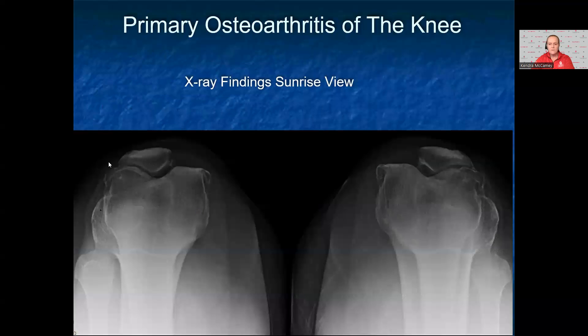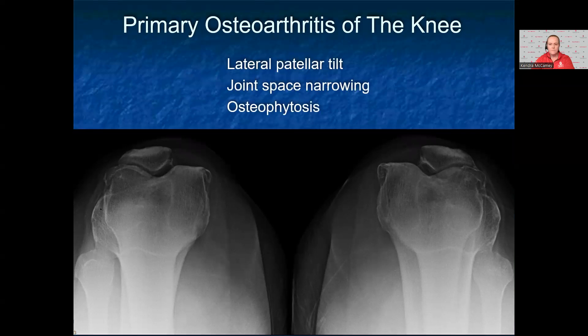This is a sunrise view of a patient with the same history — again, not the same patient as the prior x-rays. This sunrise view shows that both patella lie slightly laterally with a lateral patellar tilt. There is joint space narrowing bilaterally on the lateral side of the patella, and osteophytes bilaterally. This is again consistent with knee osteoarthritis.